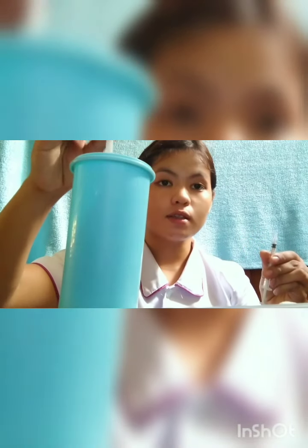And I'm gonna put it here, in this container, to avoid needle stick injury. And I will replace that into the injecting needle. Prolonged exposure to the air or contact with a moist surface will contaminate the needle. This one. So now we have the medication.